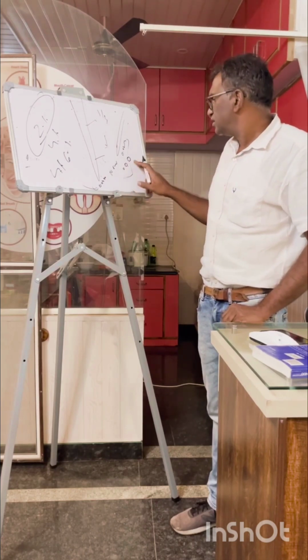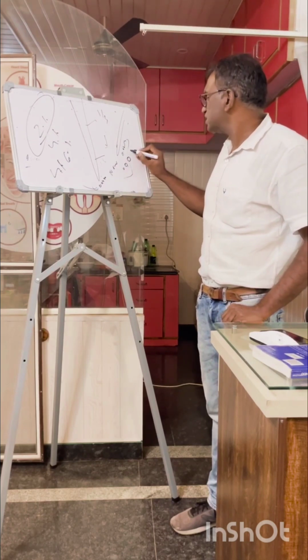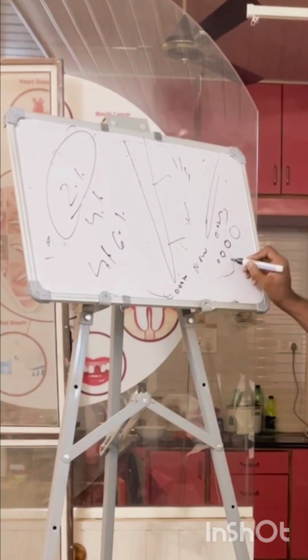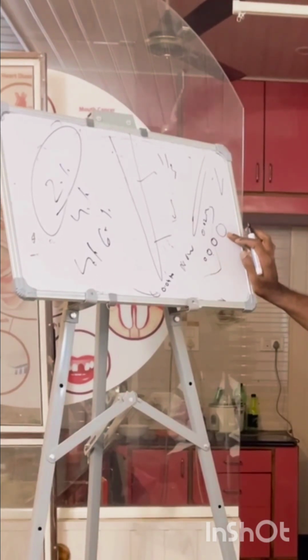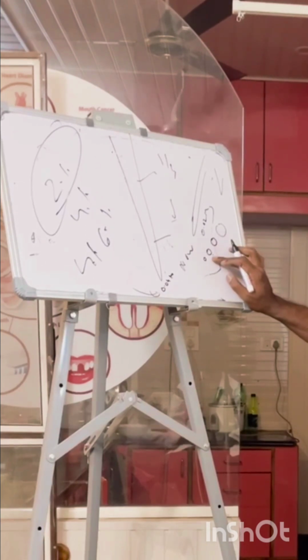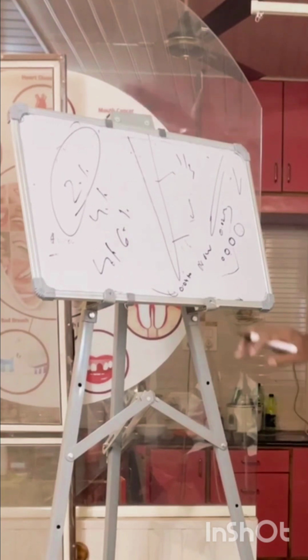Correct. 6%, 4%, 2%. Basically the thickness of an 8% file will be more thick inside. If you take the tip of the 8% file, the diameter is more here, less compared to here, even less here, very less here. See, this is taper.